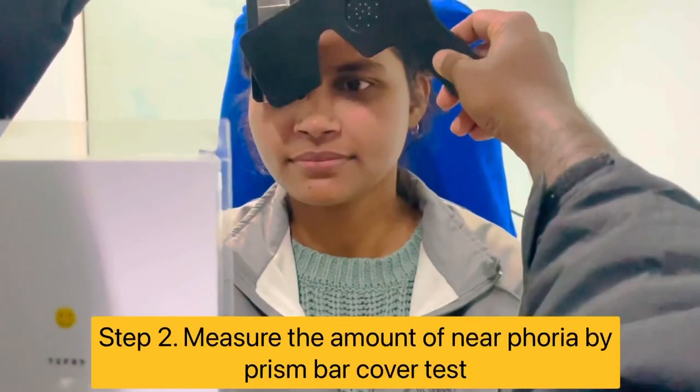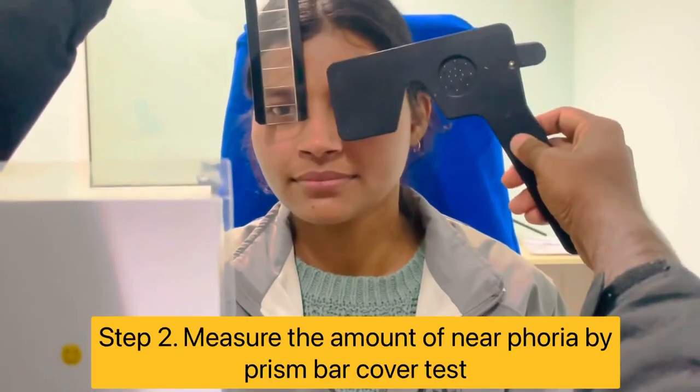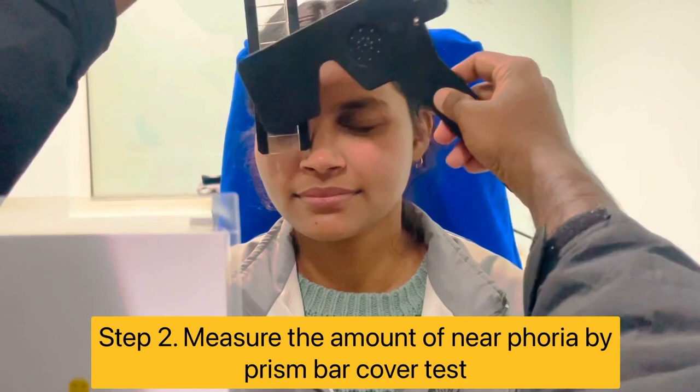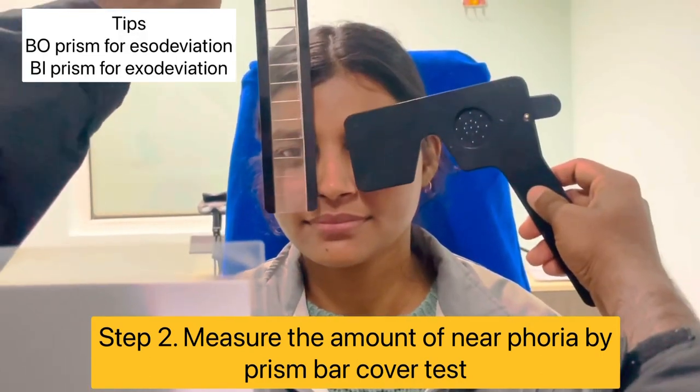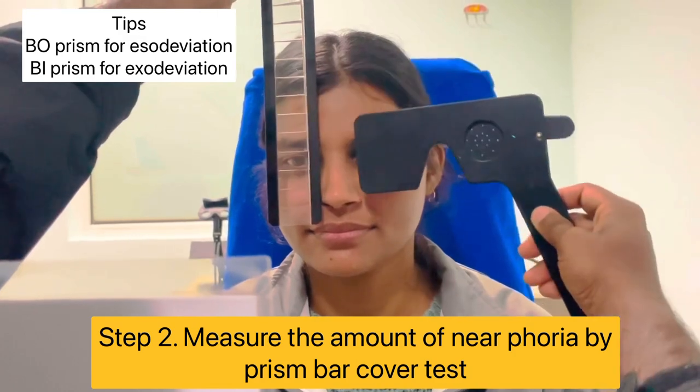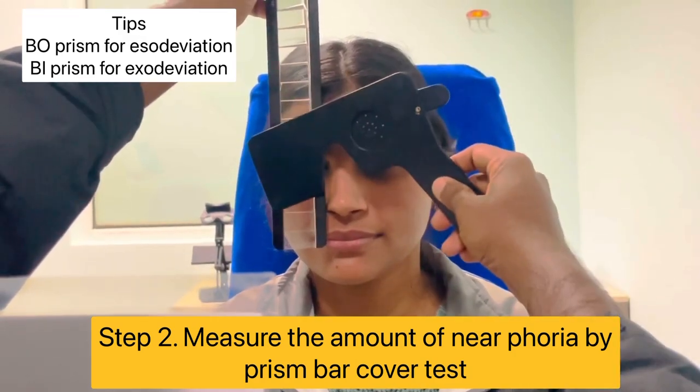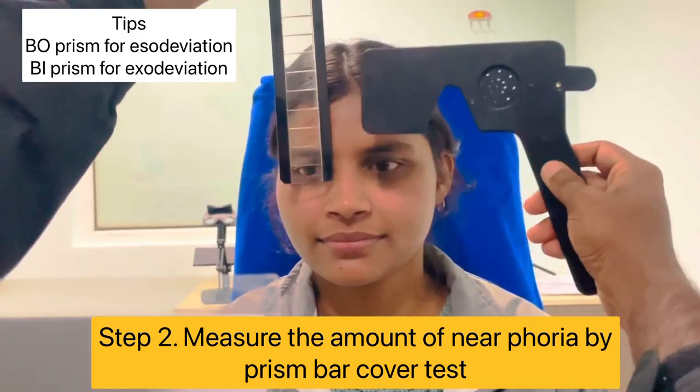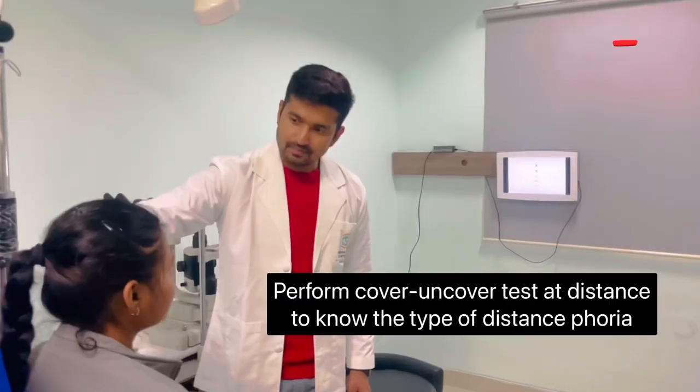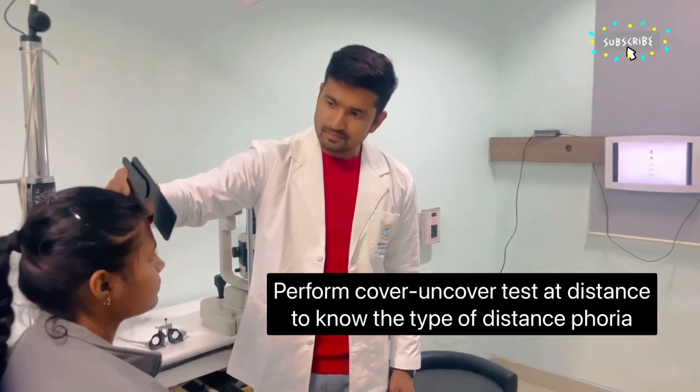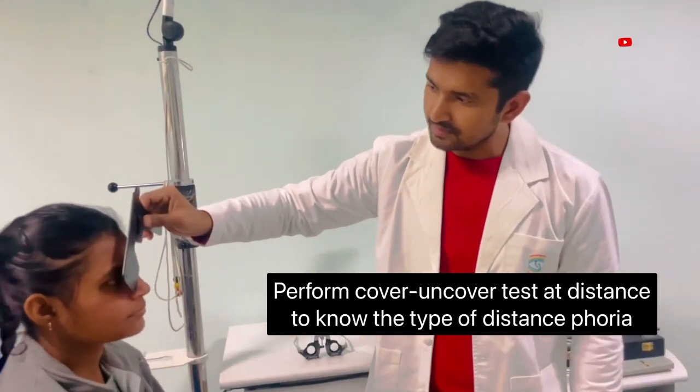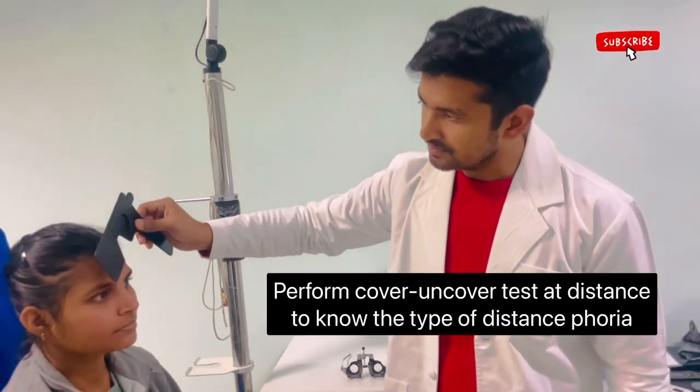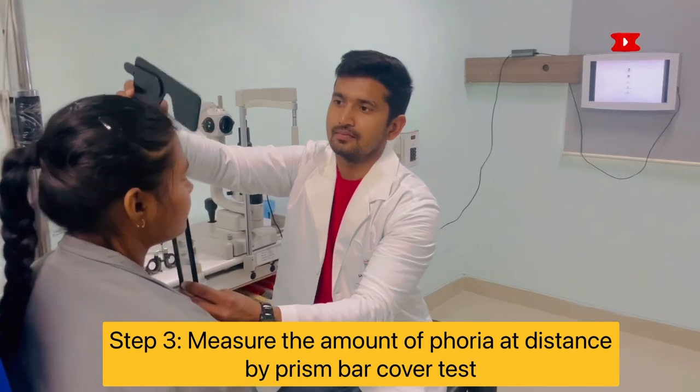Now use prisms to neutralize that phoria. For esodeviations, use base-out prism. The third step is to measure the distance phoria. Again you need to check the type of phoria by performing cover-uncover test and neutralize that phoria using the prism.